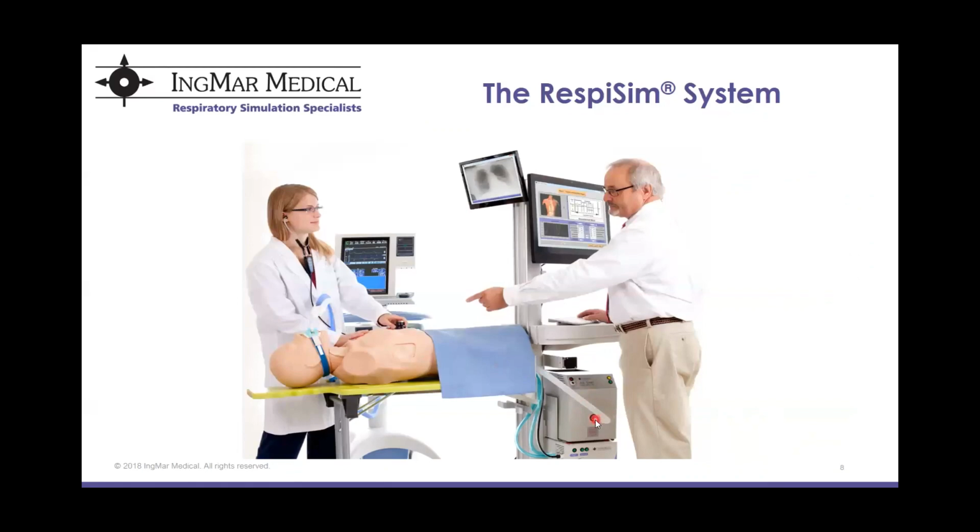You can see down here, this box is the ASL 5000, and there is a tube coming from the mannequin directly to the ASL. So the ASL is the lung here. It's just underneath the cart. You can wire directly into this black port right here if you wanted to. So for neonatal and pediatric simulations, we suggest that you just put the ventilator circuit directly into this port, and you could use a mannequin as you can jerry-rig the circuits to make it look like the patient is intubated when really it's connected to the ASL.